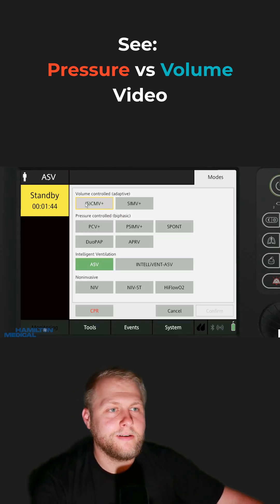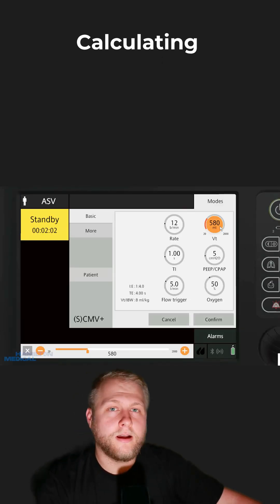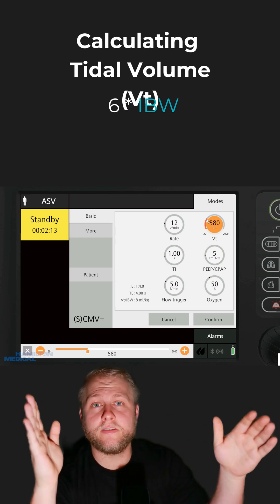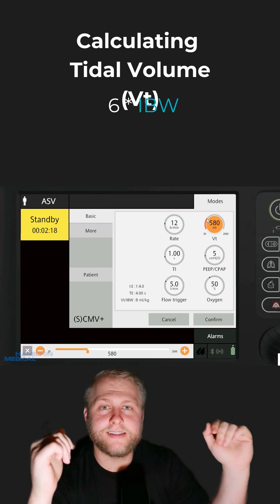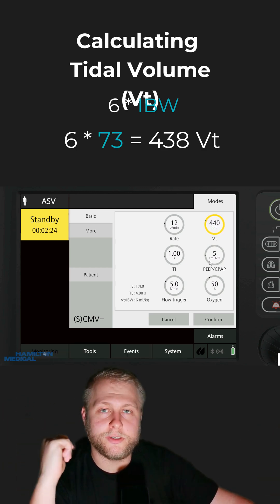Now let's choose a mode. For simplicity's sake, we're going to do CMV+, which is just volume control. We'll get into the modes a little bit later. Next thing we need to know: what's our tidal volume going to be? We're going to take 6 times our ideal body weight. Technically it's a range — anywhere from 4 to 8 multiplied by ideal body weight — but 6 is a safe bet. 73 times 6 gives us somewhere around 430-something, so we'll just put in 440.